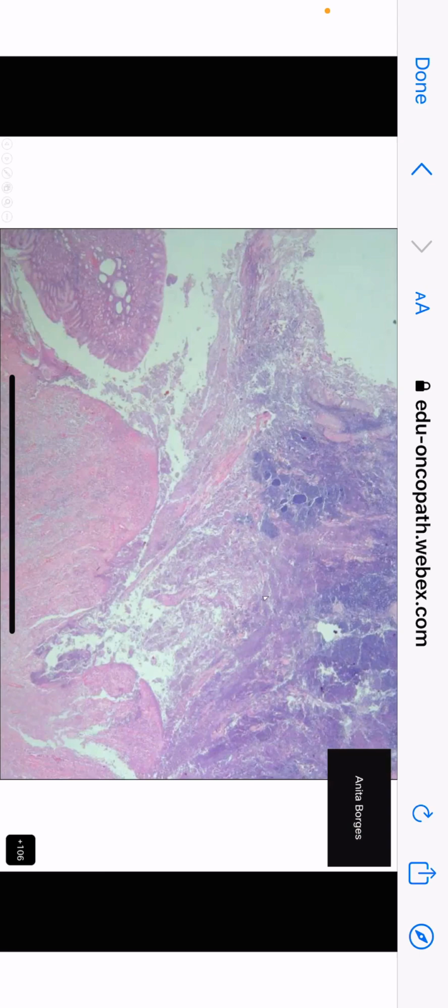Except, what is it looking like here? It's like a volcano, no? You see that there is an ulcer here. It's an obvious ulcer. Yes or no? Yes, ma'am. And this ulcer has almost an everted edge. It is like a volcano that is seen over here.